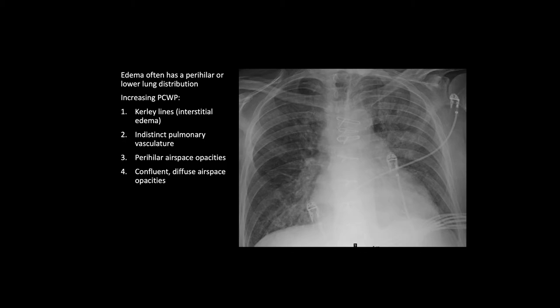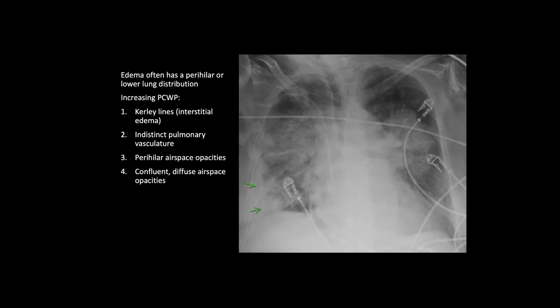As the edema worsens, you develop perihilar airspace opacities. In this case you see haziness and indistinctness of both hila and a hazy airspace opacity in the central parts of both lungs. The bases also tend to be involved in pulmonary edema, and in more severe edema you'll have more confluent dense airspace opacities, even progressing to almost whiteout in some cases.